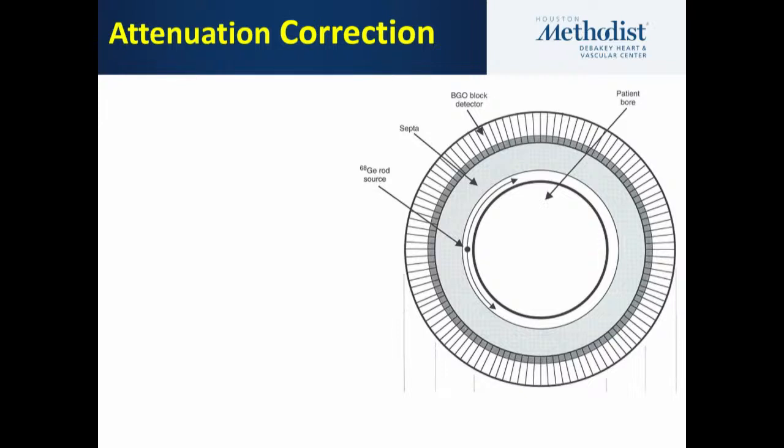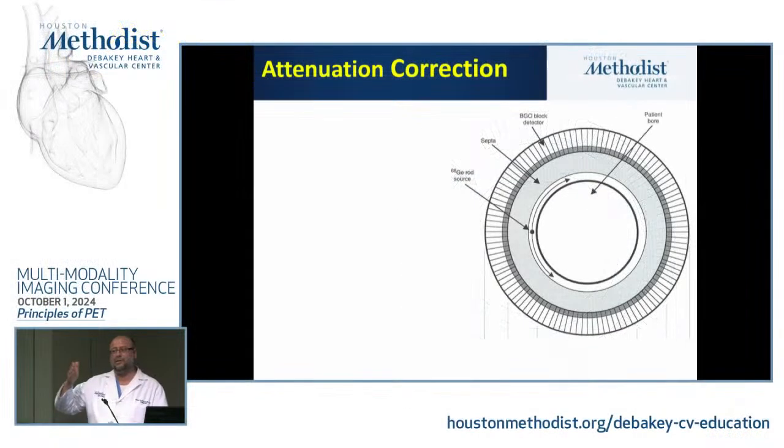So you cannot read non-attenuation corrected images. There is only one nuance in PET that I'm not going to go over today, where we look at non-attenuation corrected images. So in general, we only look at attenuation corrected. But in the process, if you talk to the techs, they generate these non-attenuation corrected images, but we label them here as "do not send." So the techs know that they don't need to send them from the machine. They look at them, they correct them.